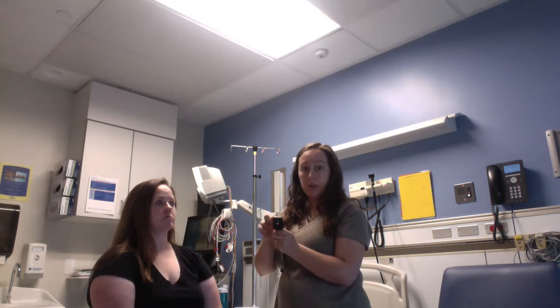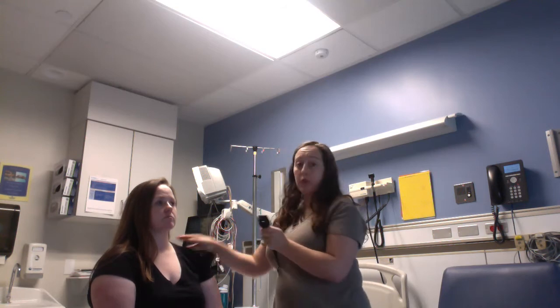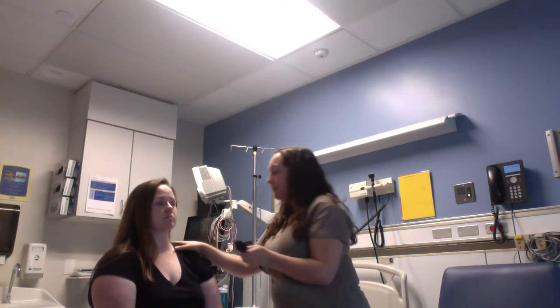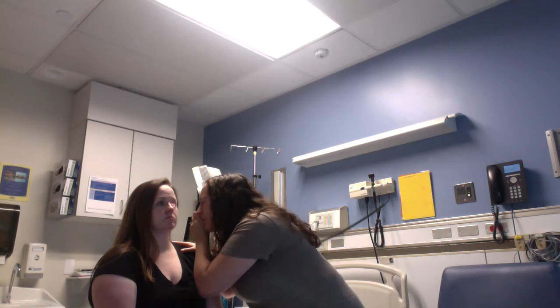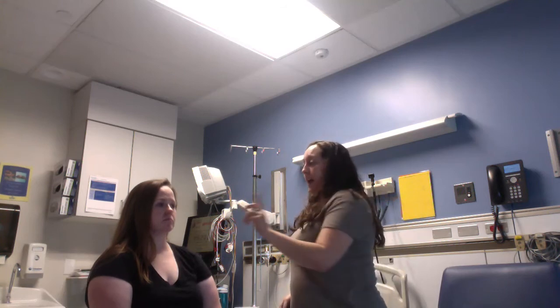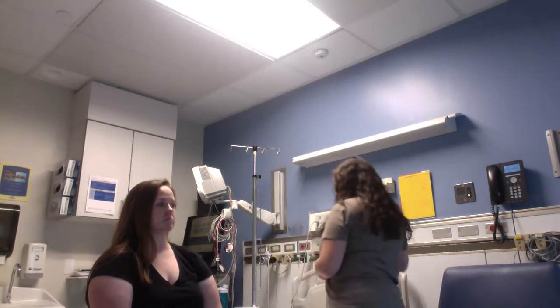And as we're coming in, we're looking at that red reflex in the scope, and we're following it into the patient's pupil. And we'll be checking for the retinal vessels. We're going to be checking the optic disc. We're going to be making sure that the anterior chambers are transparent. So again, we're going to follow. So we didn't see any foreign bodies, which was good. And at this point, we would move on to the next eye and perform the same thing.